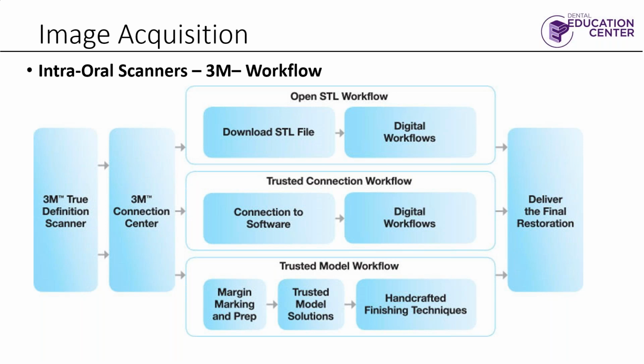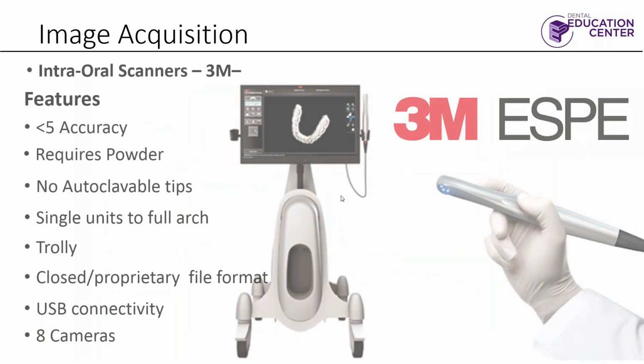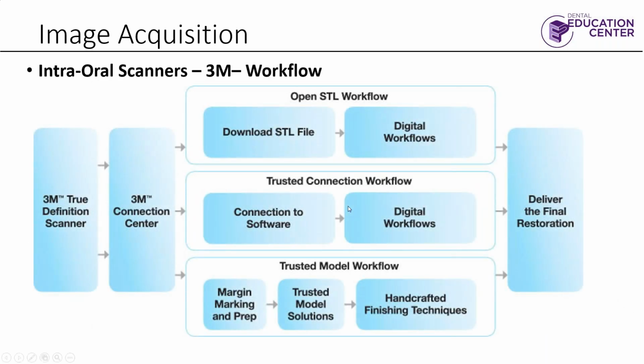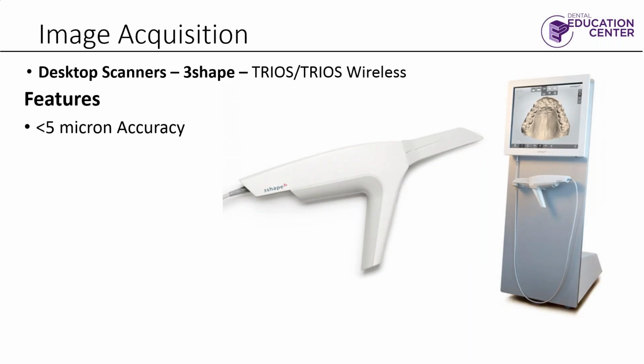I understand this stuff, and when I first saw this, I was confused by the workflow. Keep the workflow simple. Should go scanner right into your computer, directly into your computer. It just makes your life a lot easier and controllable.